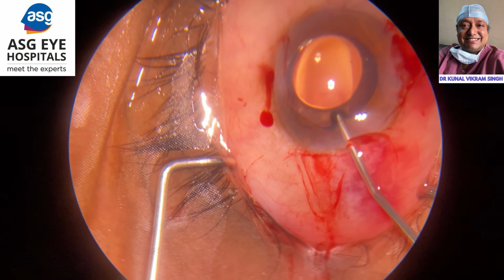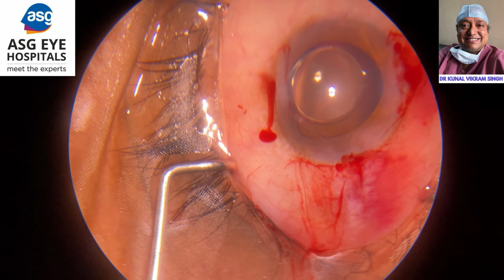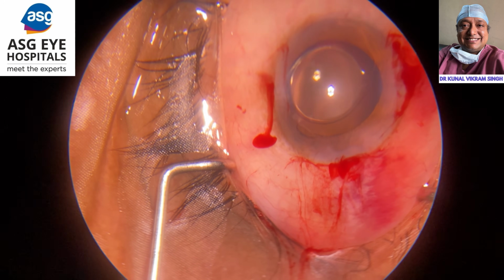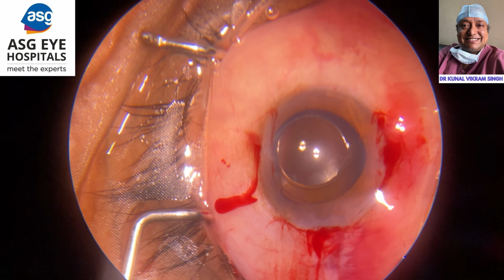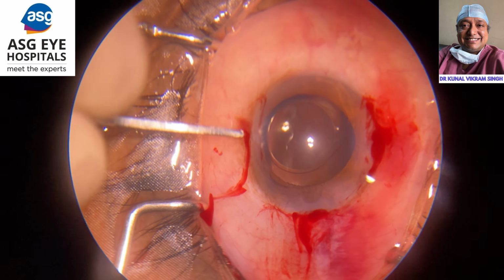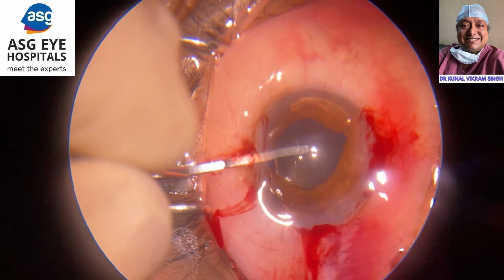Now you can also see the iris was hinting to come out, and I now knew that it's a case of aqueous misdirection, and I have to manage it accordingly. Even at this stage, as my last ditch effort, I thought I'll take an iris repositor and press down the iris and the IOL inside the bag. But that effort was futile.